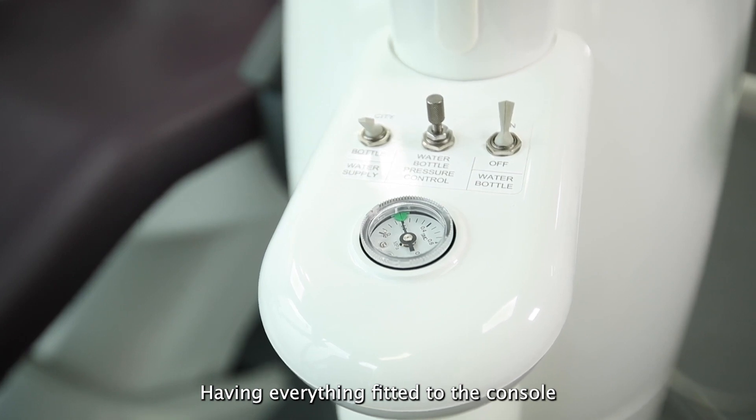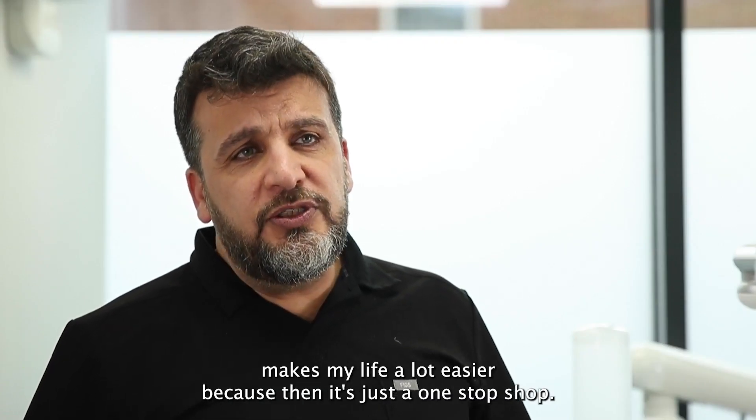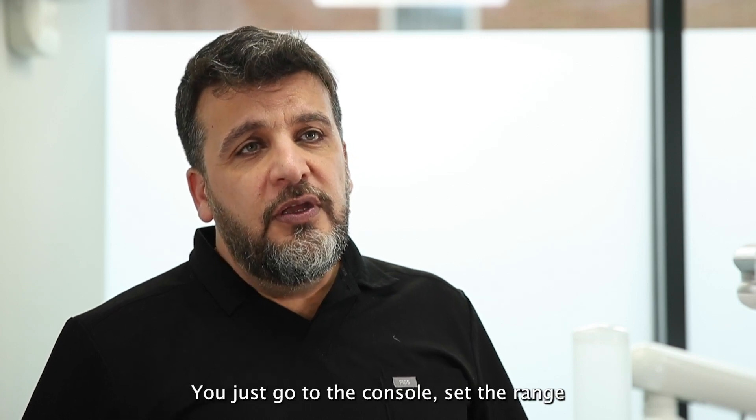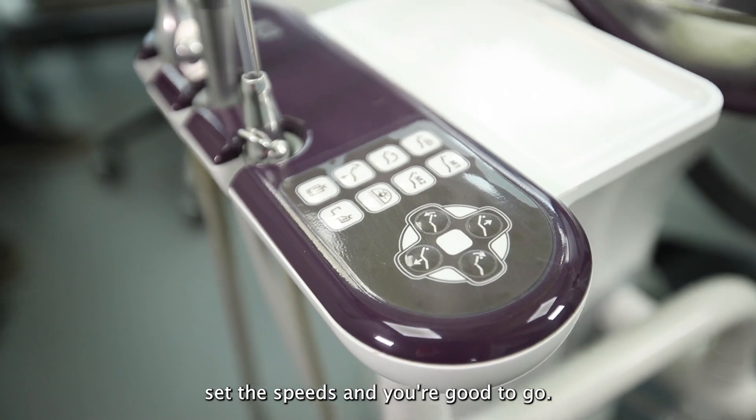Having everything fitted to the console makes my life a lot easier because then it's just a one-stop shop — you just go to the console, set your range, set your speeds and you're good to go.